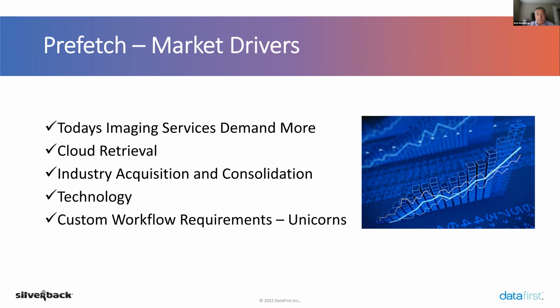One of the largest drivers is acquisitions. We're seeing an unprecedented amount of roll-ups to enterprise health delivery systems, and one of the big challenges in all those acquisitions and consolidations is getting your prior exams online and viewable.